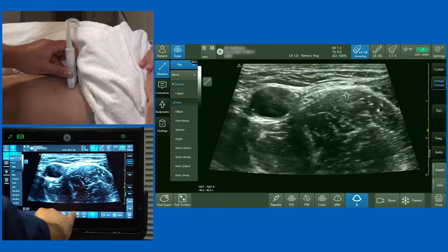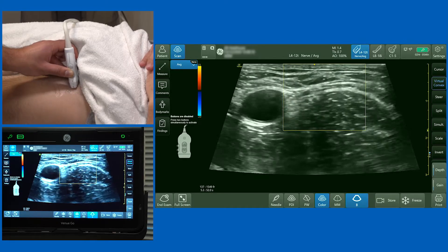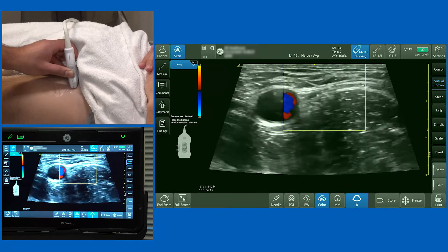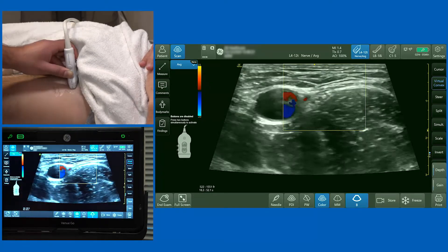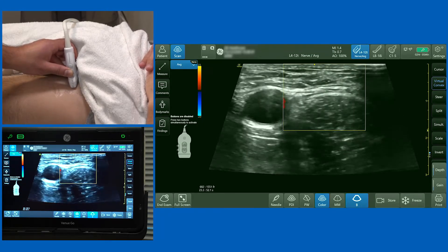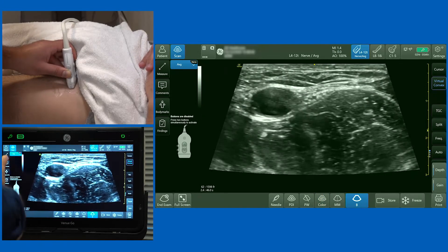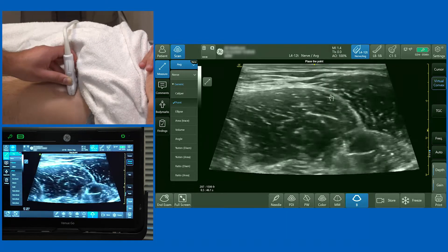The last thing I'm going to do for completeness is put the color Doppler on, because it's not unusual to see the lateral circumflex femoral artery in that area. You can see a structure leaving the femoral artery and passing over the surface of the femoral nerve — that's the lateral circumflex femoral artery, just picking up on the Doppler. Always use color Doppler to identify any extra vasculature.